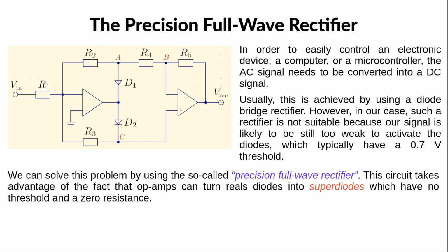Now, using AC signals to control electronic devices is not simple. It is much more convenient to use DC signals. In order to perform the conversion AC to DC, it is common to use a diode bridge rectifier. However, in our case, this wouldn't work because our signal is probably still too weak to activate the diodes, which typically have a threshold of about 0.7 volts. The solution consists in using a precision full-wave rectifier. The idea is that when an op-amp is associated with a diode, it can behave like a superdiode, a diode with no threshold and with a zero resistance. Check my tutorial about op-amps in order to learn more about superdiodes.